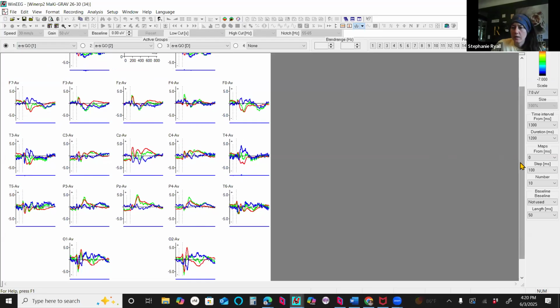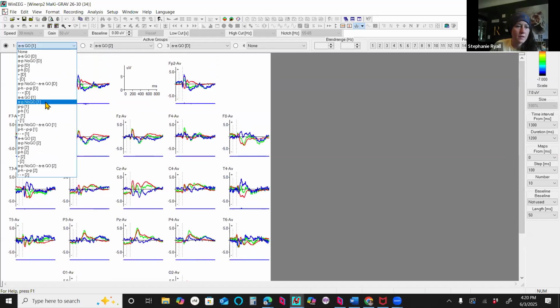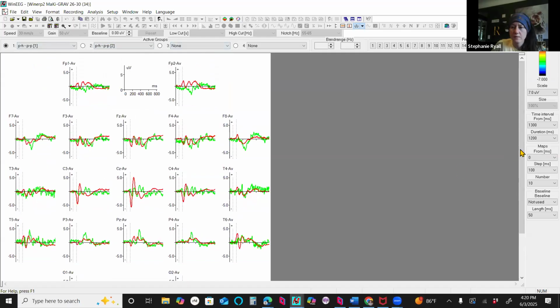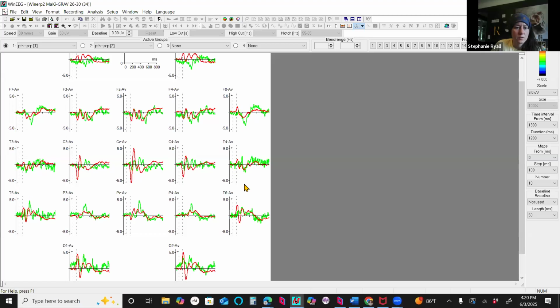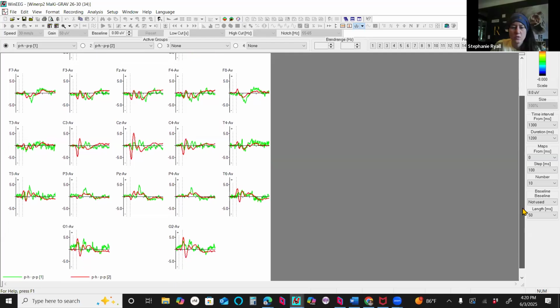So there's a lot more that I could process through, but this at least helps you prepare your record and know how to click your auditory stimulus here, cut off the difference. And you can always scroll to zoom, but make sure in your report, just for cleanness sake, that you are scaled to the same microvoltage for each one. I hope that helps. All right.